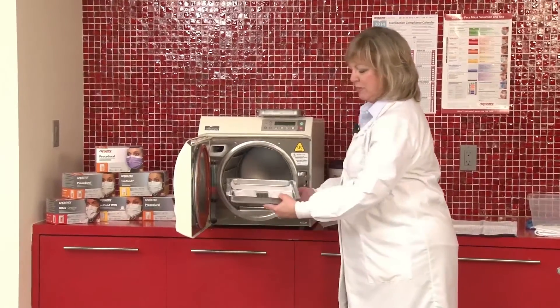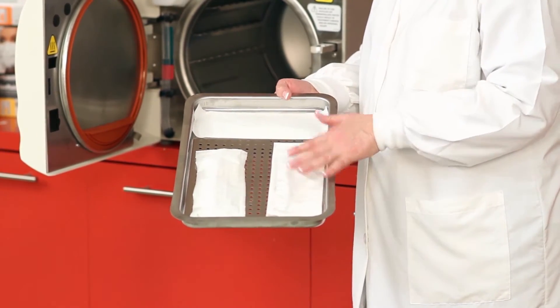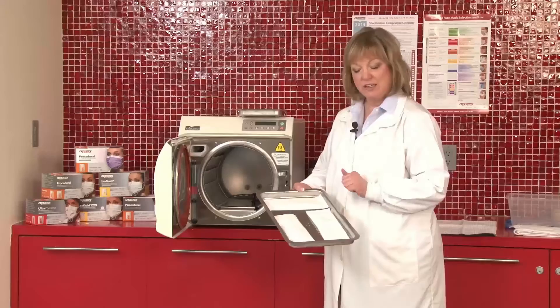To show you an example of what a pouch may look like when it's still wet, you can see that there's a little bit more of the crinkling. It's a little bit more transparent. This pouch would still be wet and shouldn't be touched until it is totally dried.